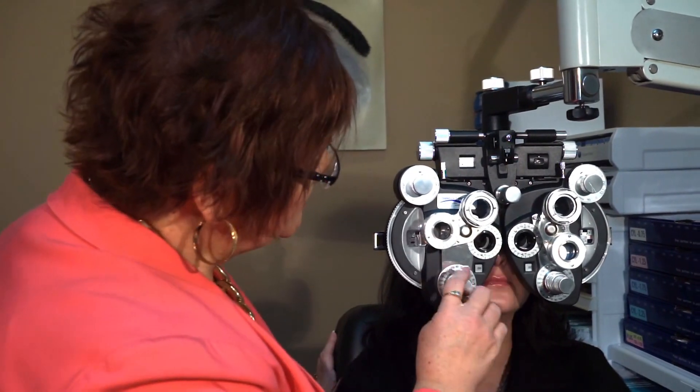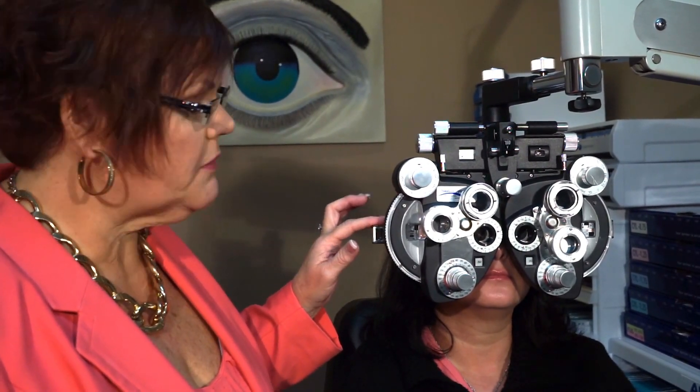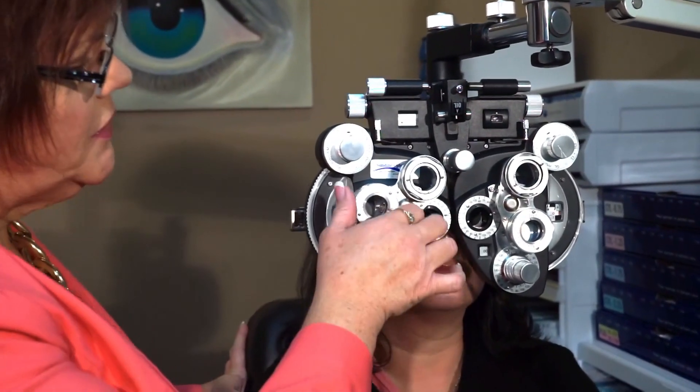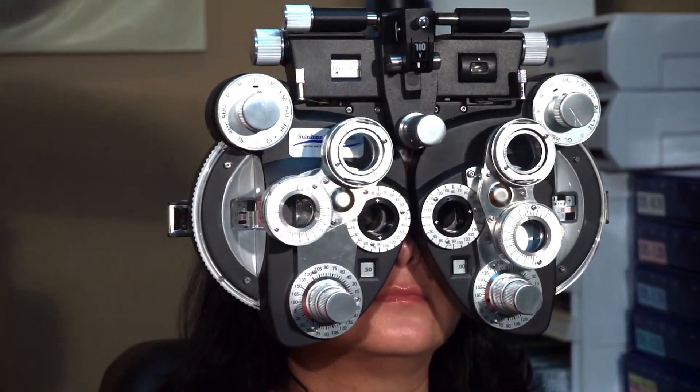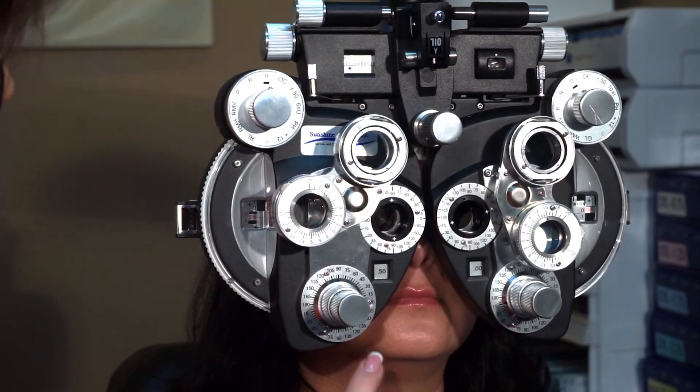Now I'm going to see if she has any astigmatism. I'm going to do what I call hunt for cyl. I'm going to determine does she have any cylinder power, and the way that I do this is I'm going to put in a half-diopter cylinder. Because I've given her a half-diopter cylinder, I need to subtract a quarter diopter of sphere to maintain my spherical equivalent — to maintain that balance between the two. So I've given her a half diopter of cyl and I'm going to show her cylinder power at four different axes. I don't know if she has cylinder or what axis it's at.